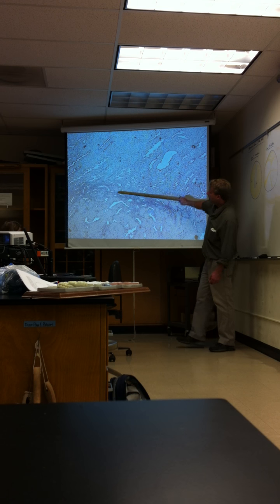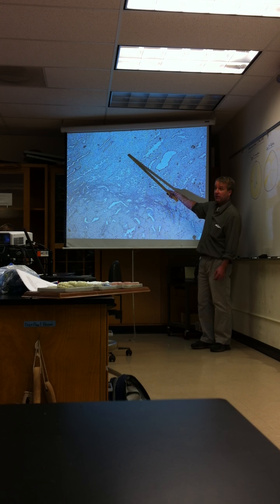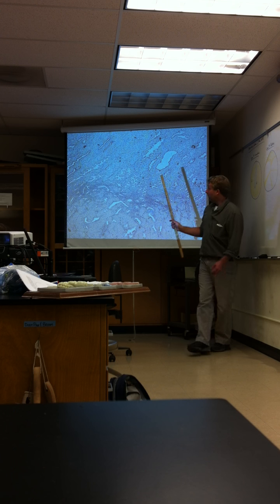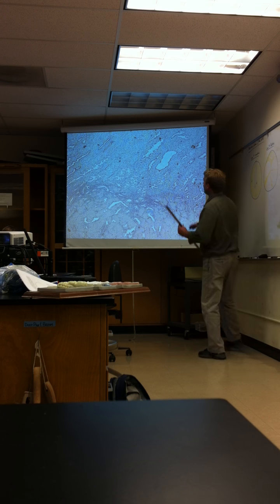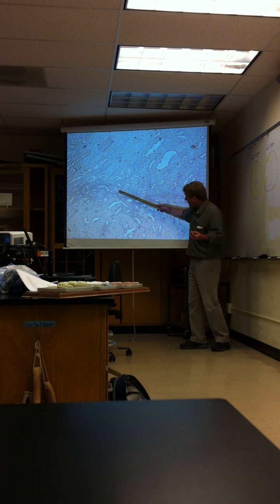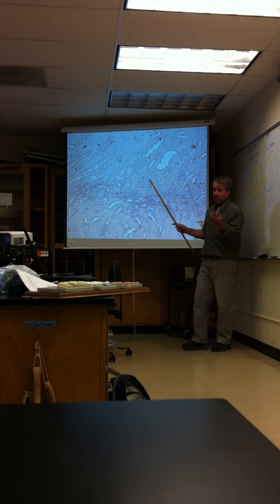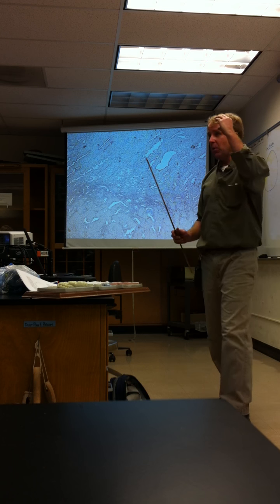Stratum basalis function is a good place. All the dark purple is to renew the stratum functionalis. And if someone has endometriosis, another good place you can kind of imagine, if someone has endometriosis, they have a stratum basalis outside of the uterus. So you have these stratum basalis cells. They're the ones that are responding to the estrogen, and they would start to grow when there's more estrogen.